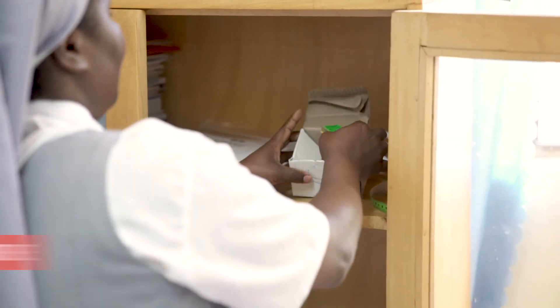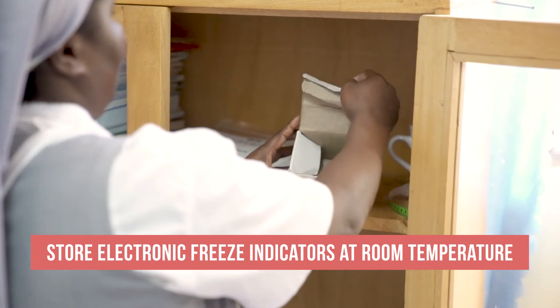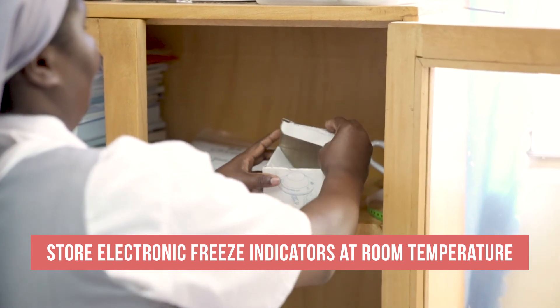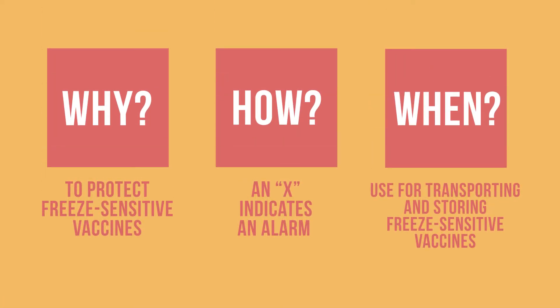After its use, store electronic freeze indicators at room temperature. Then return these devices when the next shipment is collected. You have learned why, how, and when to use electronic freeze indicators. This easy-to-read device can help you protect freeze-sensitive vaccines and make sure children are receiving safe and effective vaccines.